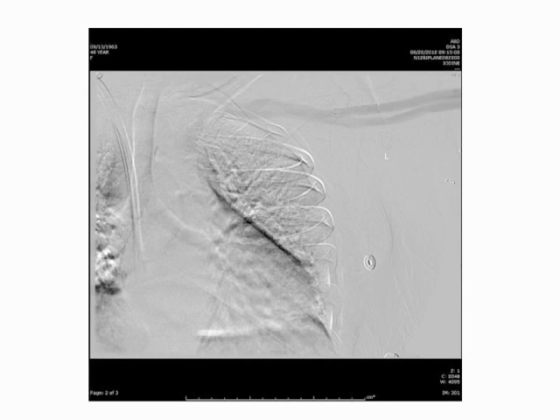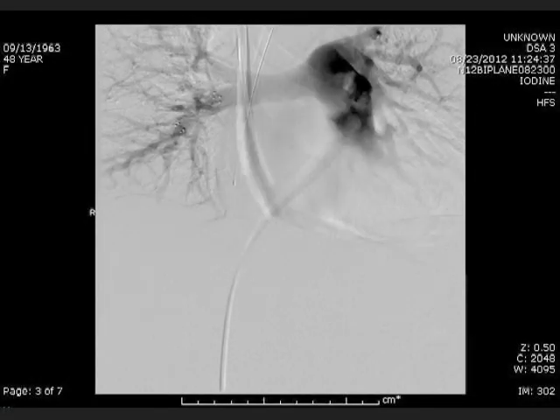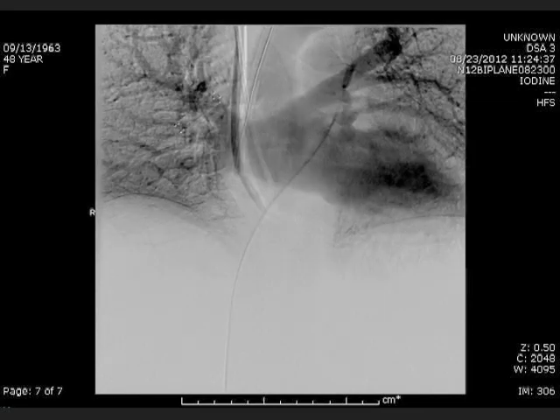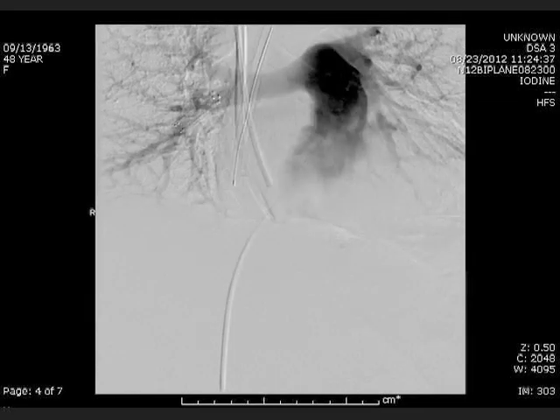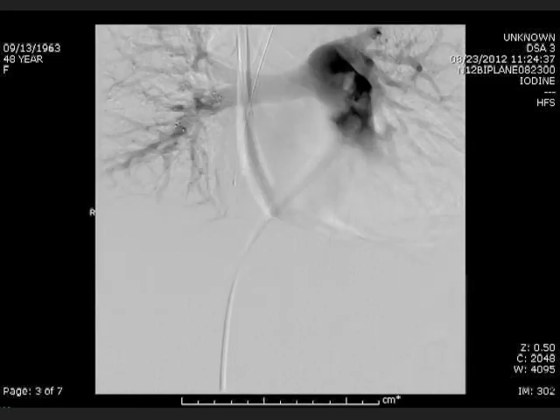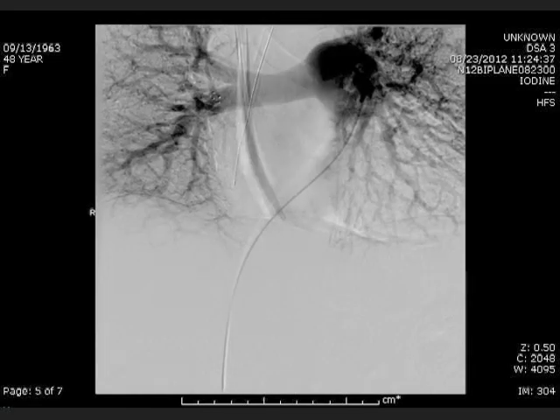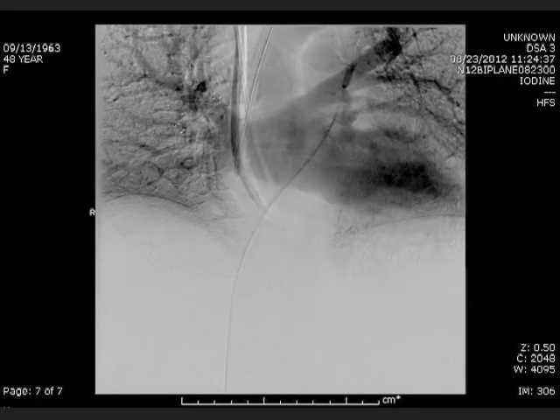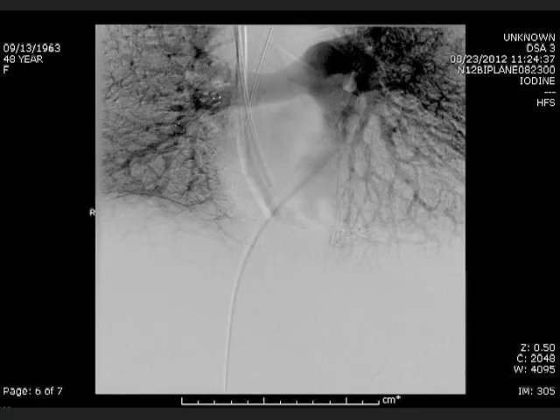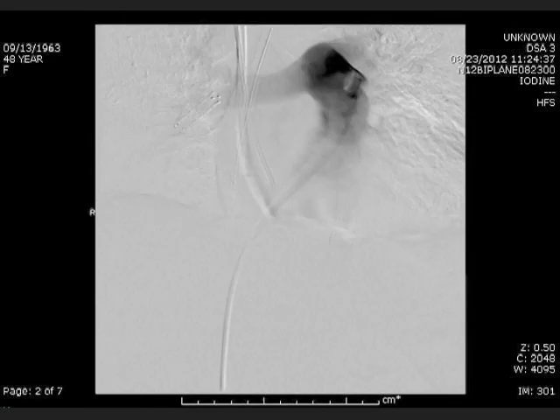The stent was successfully deployed at the venous anastomosis. However, within seconds it began to migrate. As you can see on an angiogram of the pulmonary artery, you can see the stent lodged at the bifurcation of the right pulmonary artery. The stent was later retrieved by the University vascular surgeon. He accessed the patient's femoral vein, used a snare to retrieve the migrated stent, and pulled it out through a venotomy that he made in the femoral vein.